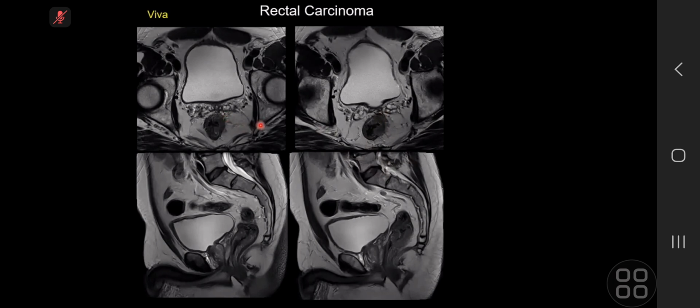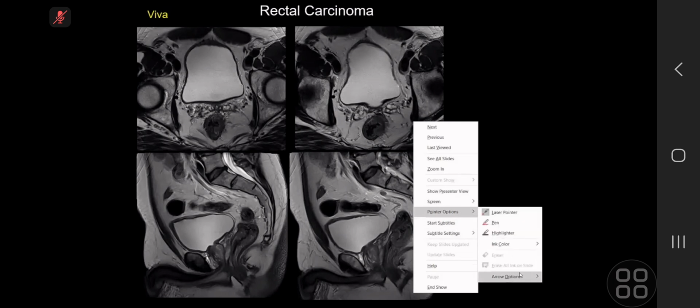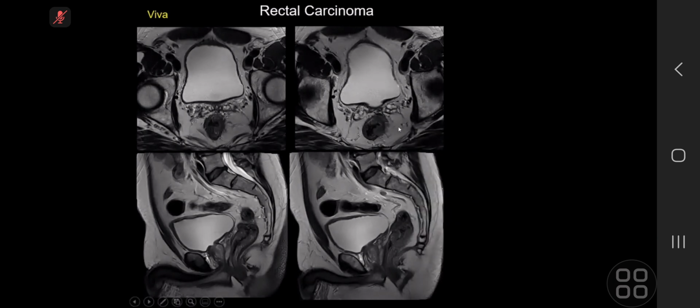No, just a bit more lateral. I can see those two lines just there. What does this mean then? I mean, it's not that thick. It means there's some sort of inflammation, but given the history and the presence of that mass, in terms of surgery you'd want to be telling them about it so they can excise and have a clear excision margin.